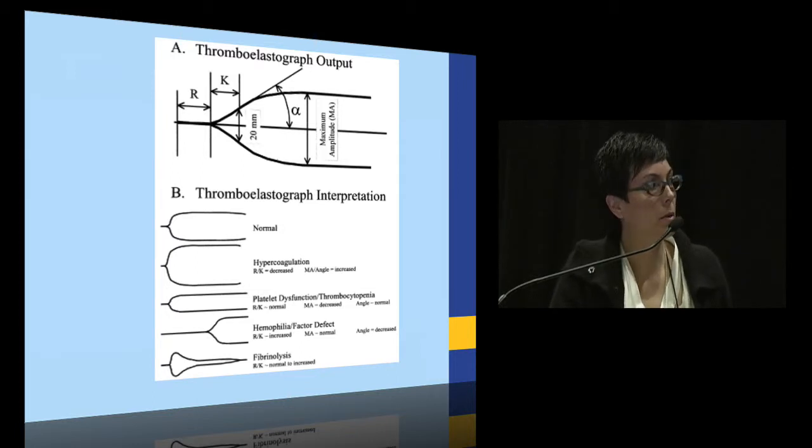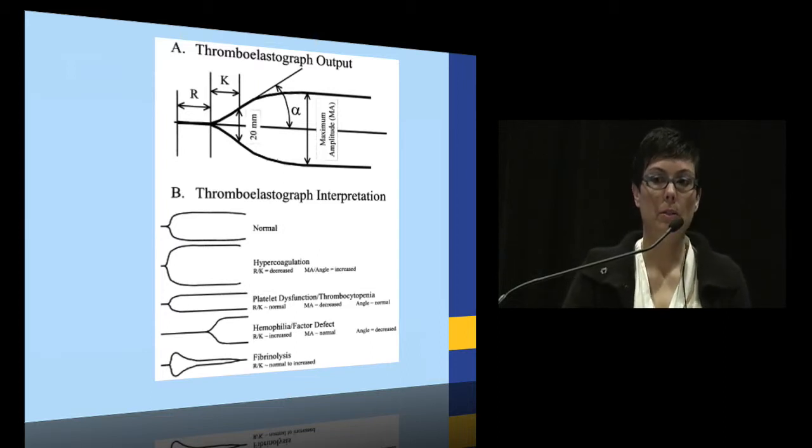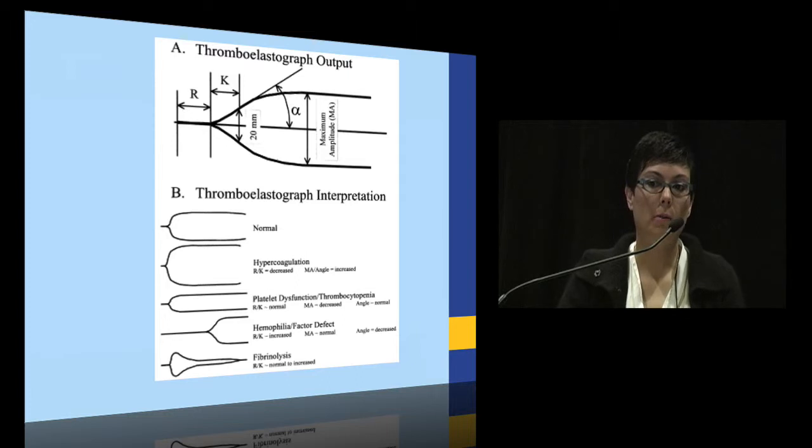And again, we've got some other ones that you can see here. Now, the interesting thing is if you can see the fibrinolysis here. Again, as we mentioned, this part of the graph is all about the fibrinolysis, okay? So those are your standard thromboelastogram interpretation for the TEG.